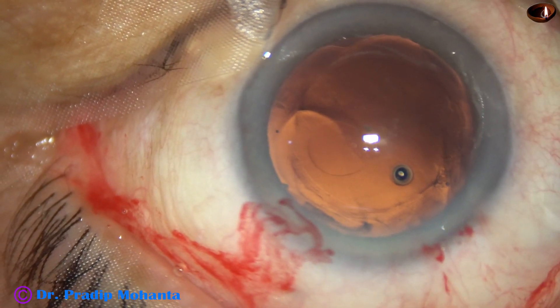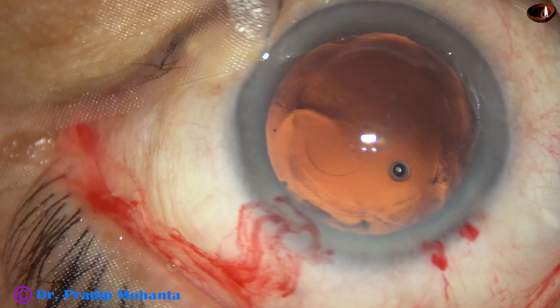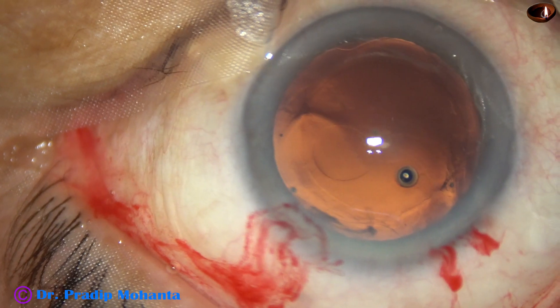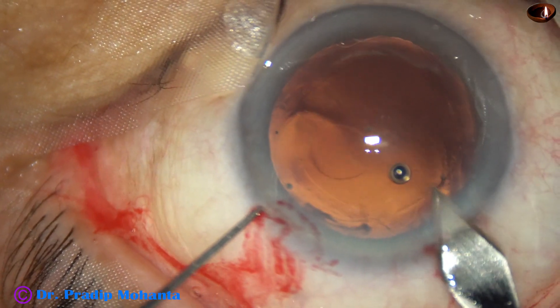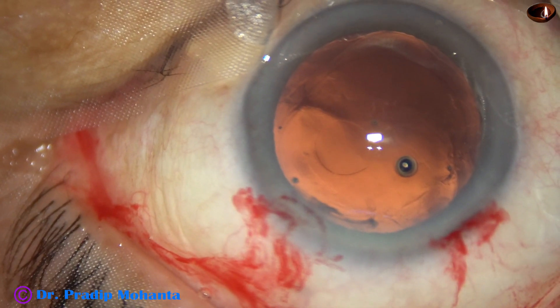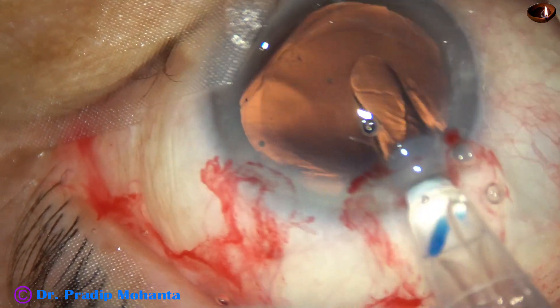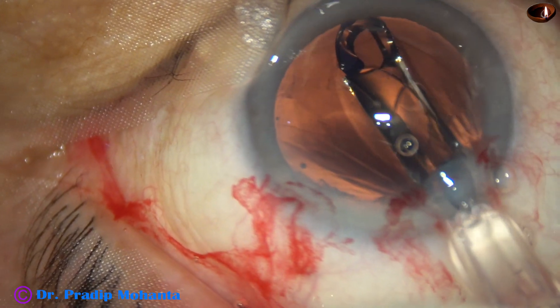The intraocular lens selected in this case is the Hoya ON50 from Japan. I want to enlarge the main wound so that the cartridge goes easily into the capsular bag. Here it is — the leading haptic goes into the capsular bag.